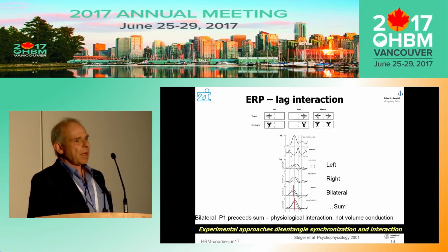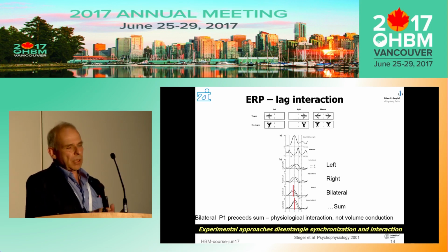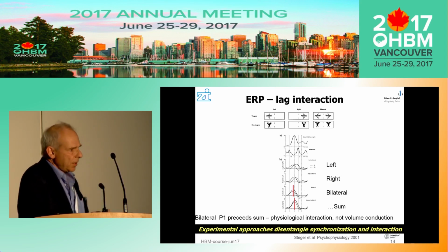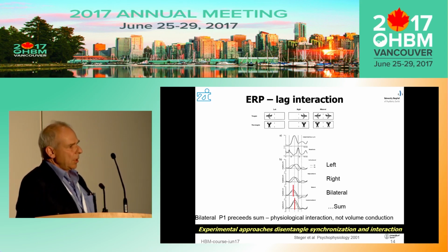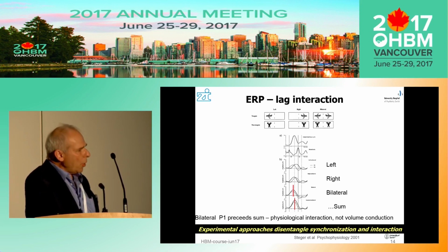Yes, one important aspect that I think is also a bit underestimated in discussions about how we can capture synchronization and lagged connectivity, complex activation patterns, is that maybe the methods themselves, source localization methods and methods getting at pure measures of information processing, progression of lags and of directed connectivity patterns, often have lots of limitations or minor limitations, but in the real noisy experimental environment, they often have major limitations.